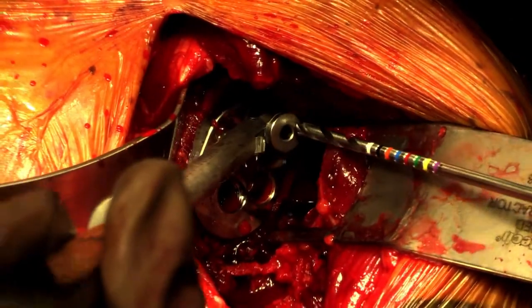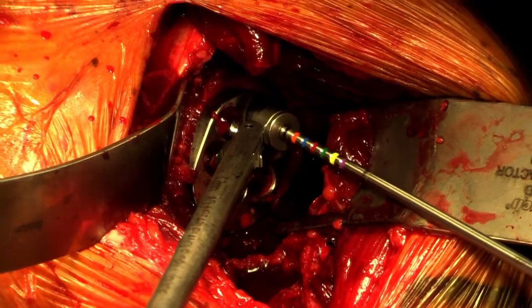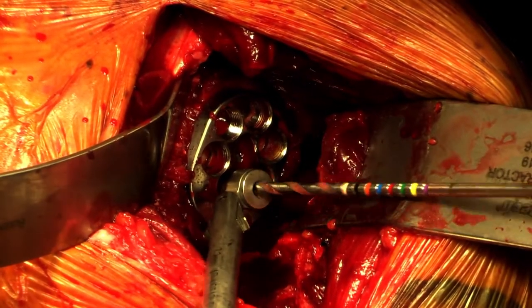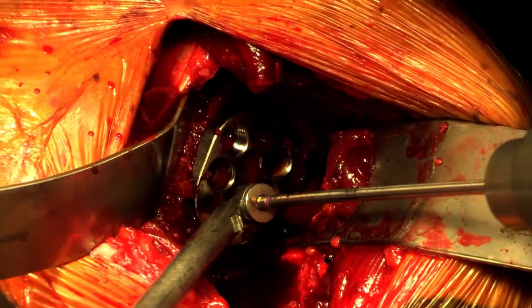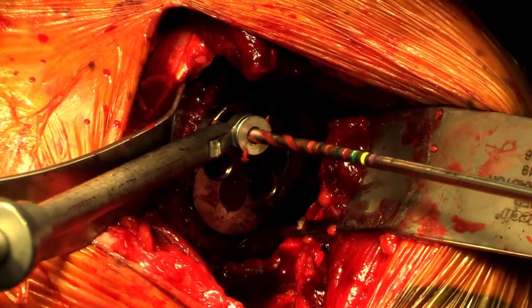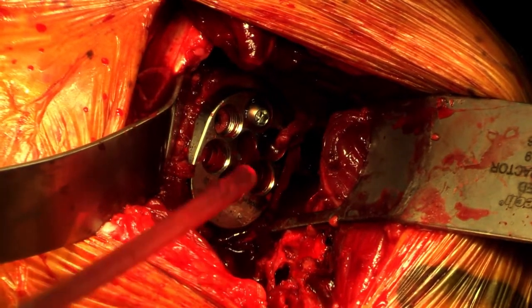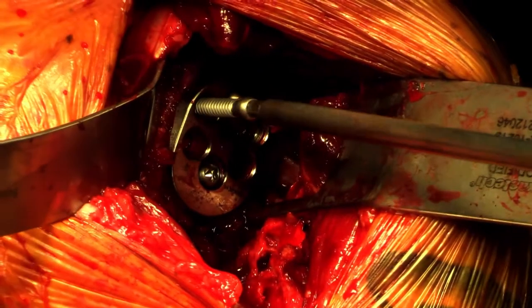This base plate offers 6 screw options. Drill bicortical with the 3.2 mm drill, making sure to observe the color coding on the drill bit to determine screw length. There is also a standard depth gauge if preferred. In this case, 3 screws were used: superior, inferior, and superior anterior. Screw sizes are determined by the color-coded drill bit. However, there is a standard depth gauge if desired.